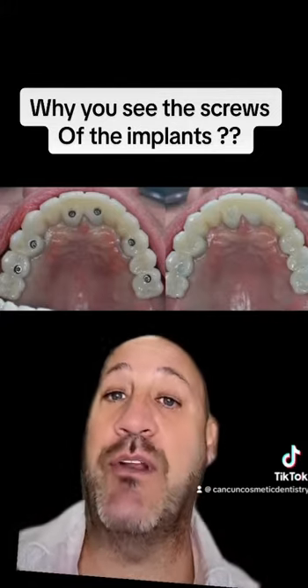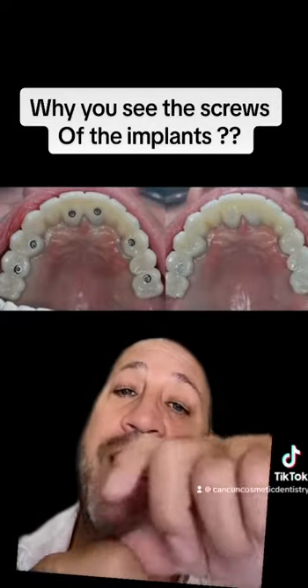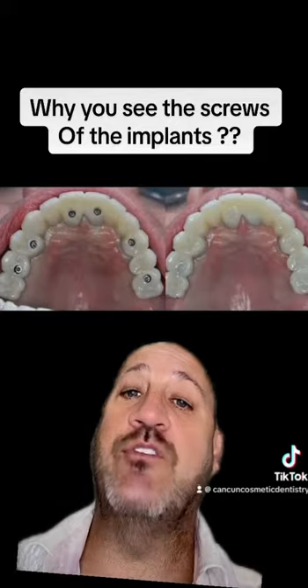Remember that we talked about it in a video. With those screws, what we can do is that we can unscrew them out and remove the bar or the bridge. Give service, put it in, and put it in again — those screws.